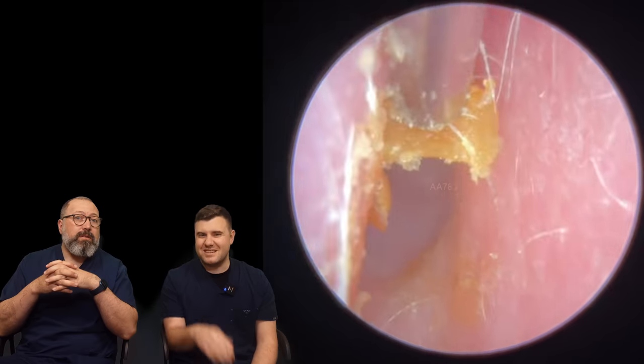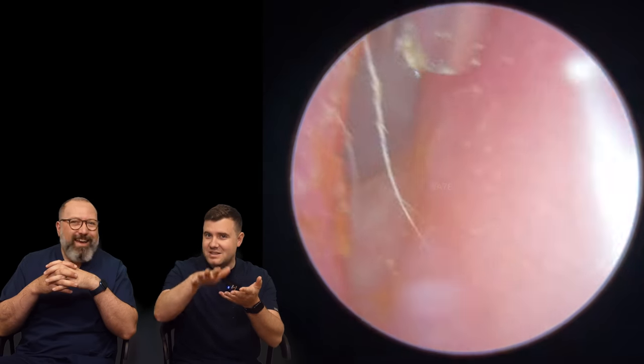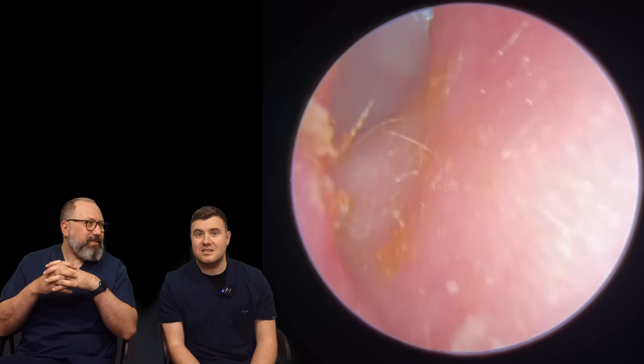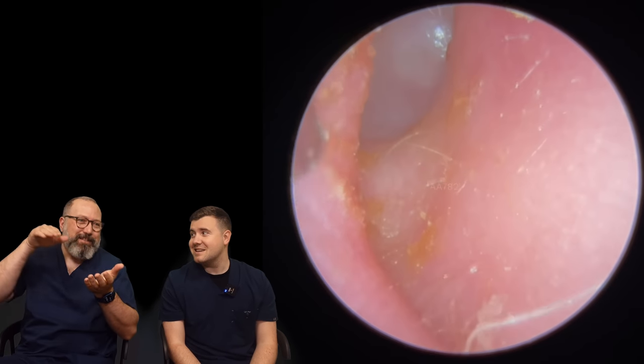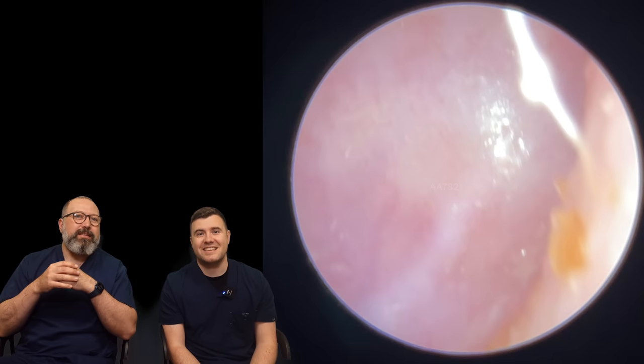They can be a bit of a nightmare sometimes to take away, because sometimes you'll have that fine layer of dead skin that starts peeling away as you start bringing them out. We're quite lucky in this case. You don't realise it's there sometimes — you start to lift it and all of a sudden it's gone all the way down.